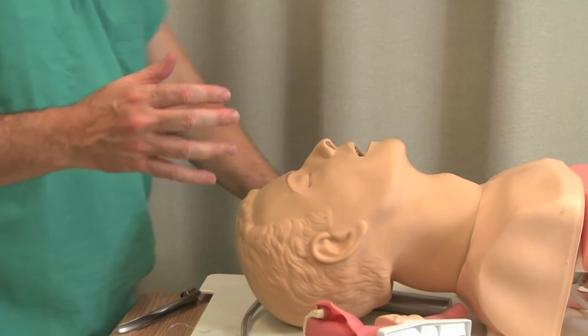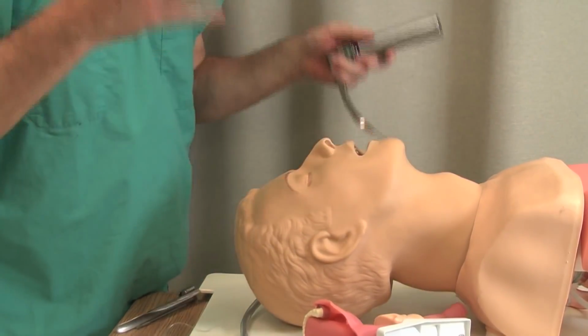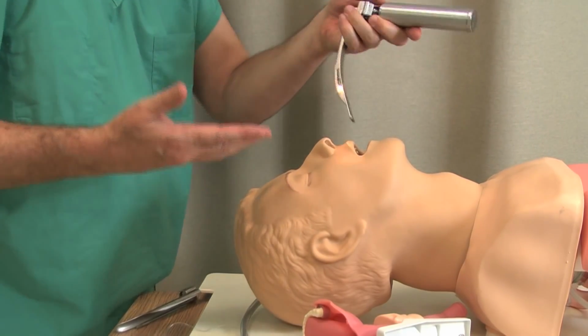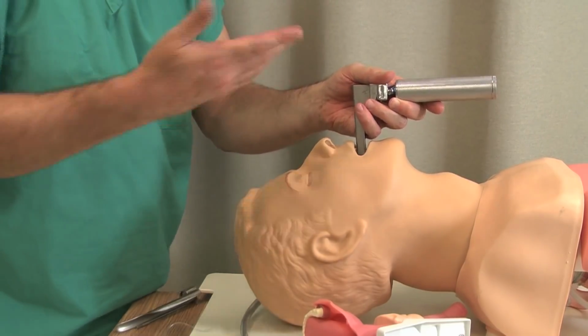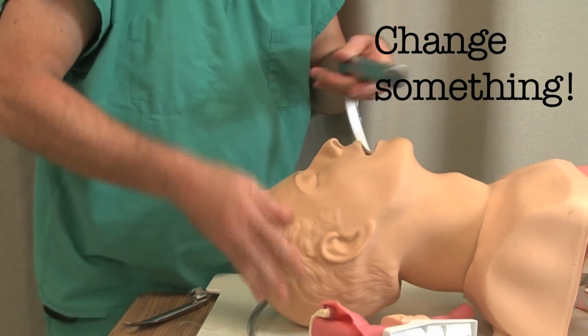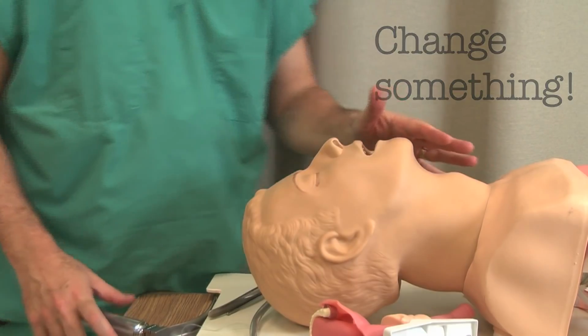Now, the whole idea is change something. Don't reinforce failure. If I have the exact same head position, exact same blade, and exact same practitioner, do I really think things are going to change? No. I mean, I'm just reinforcing failure. Change something. Put their head up more. Get a different blade. Get a different person.